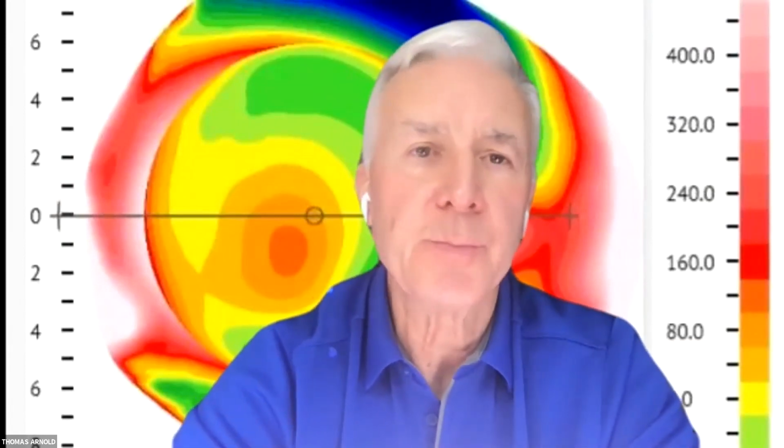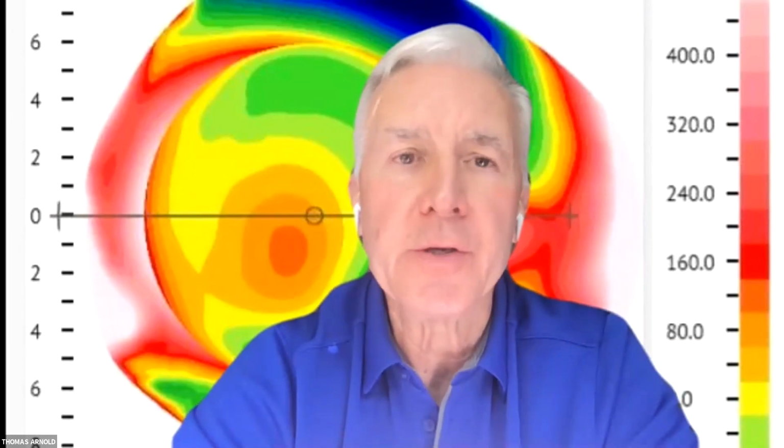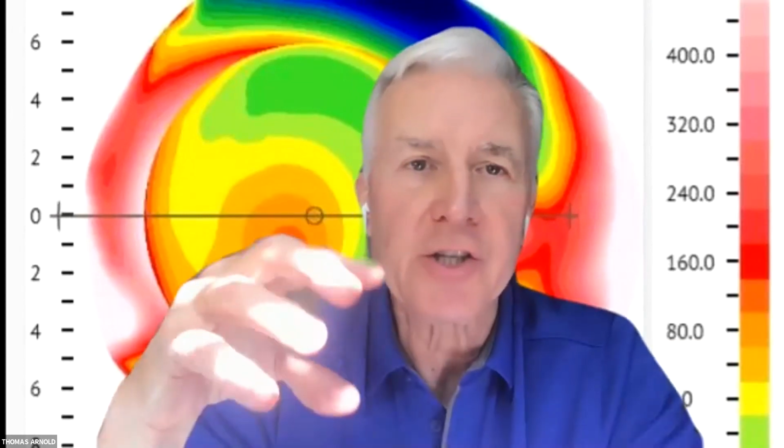Mm-hmm. Not so much decentration too, but you want some tear exchange. Yeah, I think that's what we're going for, Reinier, is that you don't want to seal it, suck it on.